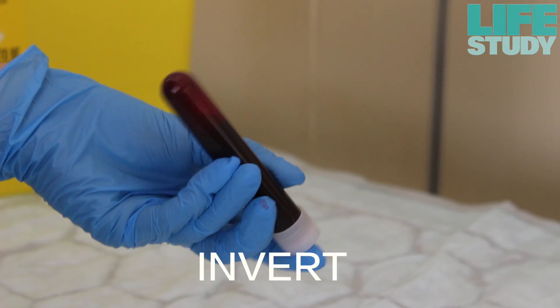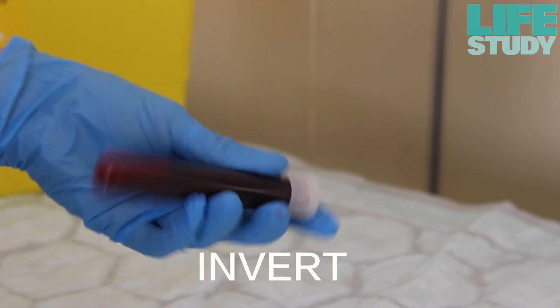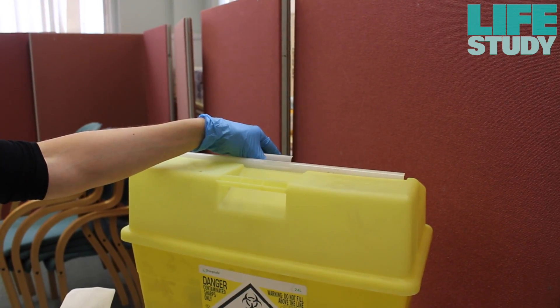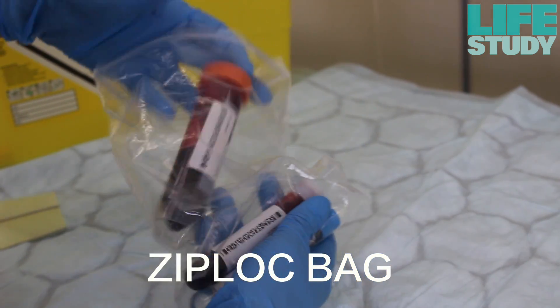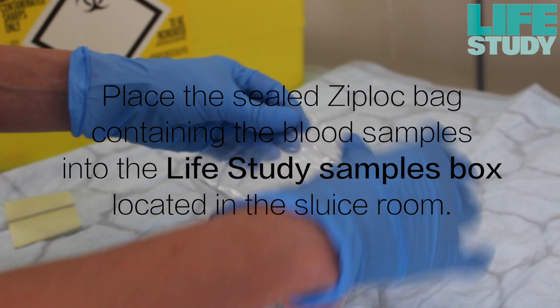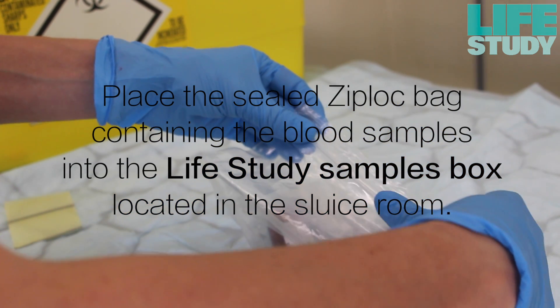Gently invert the full blood bottles 5 to 10 times to thoroughly mix the samples. Discard the syringe into the clinical waste. Place all the full bottles into the Ziploc bag.